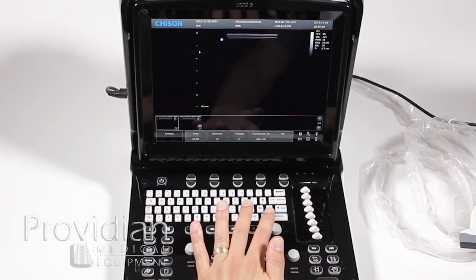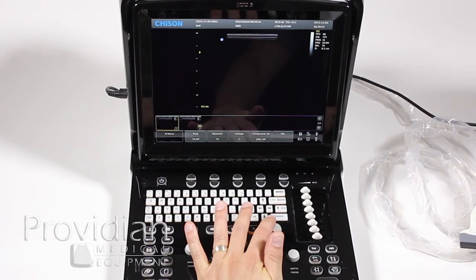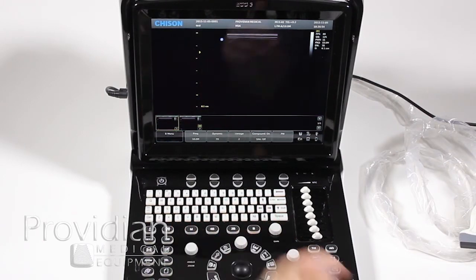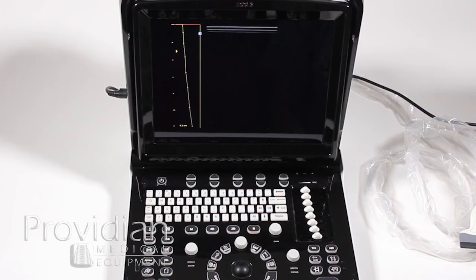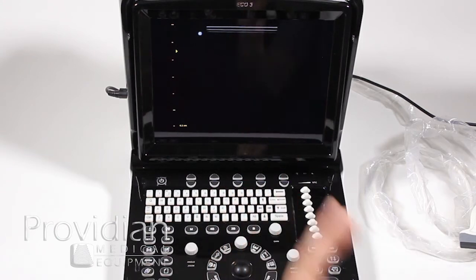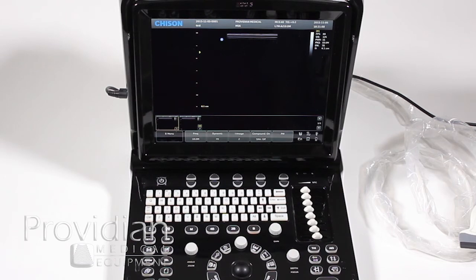Another thing about the gain button: you can go to a full screen mode — it's a bit of a hidden gem. Push down the gain key and you go to full screen, giving you a better view without all the other interface elements cluttering your image. Click gain again to exit full screen — the exit button also works for that.